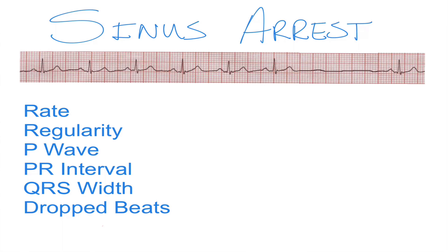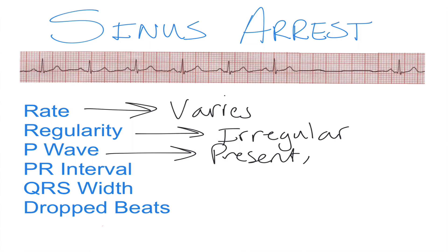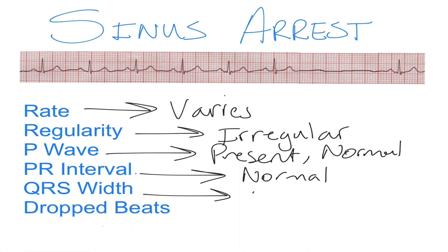In this video we're going to look at something called sinus arrest. With sinus arrest, you're going to have a rate that varies — it's an irregular rhythm, as you can see from the strip above. The P waves are going to be present and normal, and the PR interval as well as the QRS width are also going to be normal.